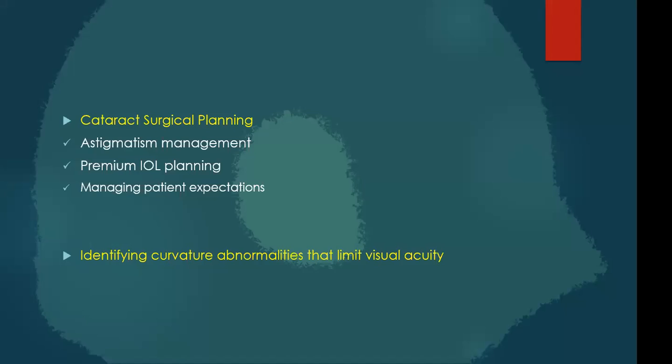It also helps us to identify curvature abnormalities that limit visual acuity. So if there is a patient whose best corrected visual acuity is not improving beyond say 6 by 9, 6 by 12, and you are seeing a cylindrical value at an irregular axis, it is important that you do a topography and try and understand what are the curvature changes or the contour changes of the cornea.